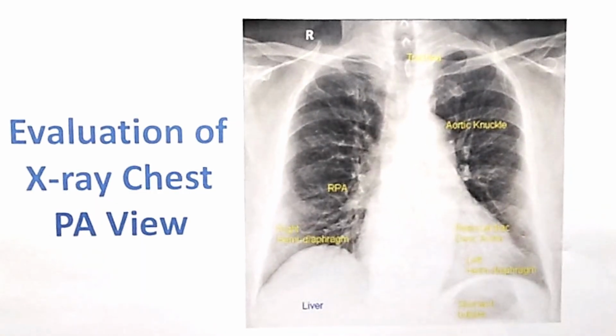Usual chest x-rays are taken in full inspiration so that the lung fields are quite clear. If you take in expiration, lung fields clarity will be lesser. But there is a specific situation where you might take in full expiration. That's when you want to see a small pneumothorax. There could be a small pneumothorax which may be better visible when taken in full expiration, as the contrast between air and lung tissue increases.